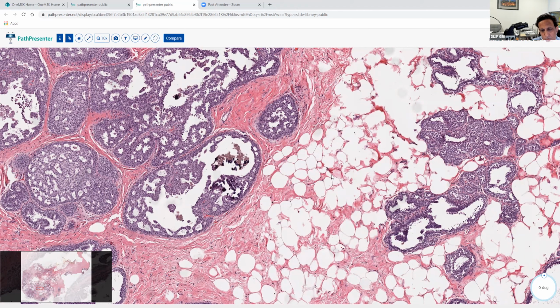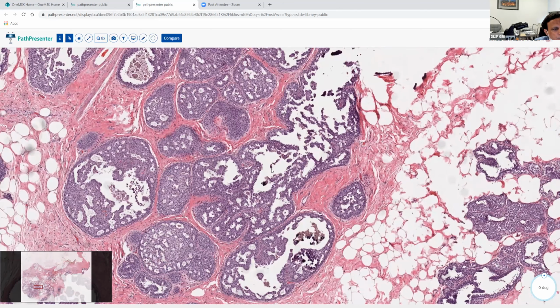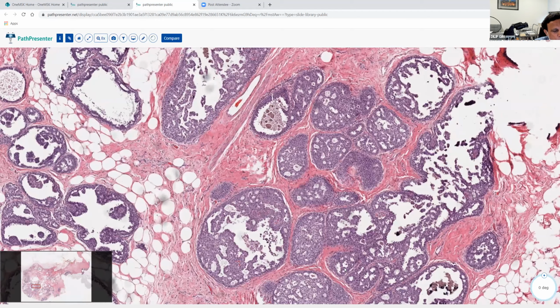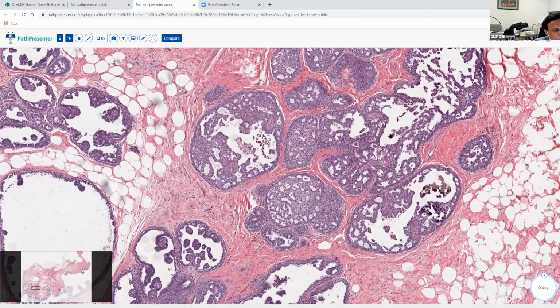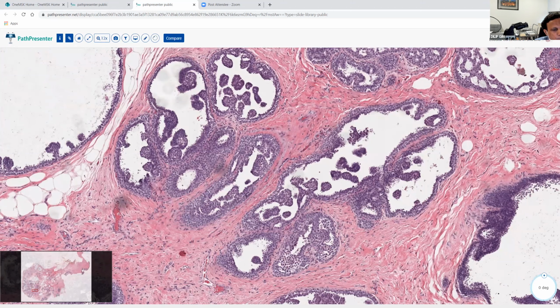So that is how lobular carcinomas, low grade ductal carcinomas and all, they all share the molecular lineage. But we do use that term collision, right? So this is one such example. You actually are seeing both the things happening in the same unit.